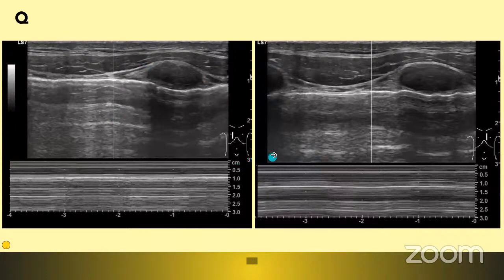So this is the lung field. You can see the small diagram here, right? This is for ease. This is the right lung. This is the left lung. See, I have taken it in M mode. Okay. So what you can see here.